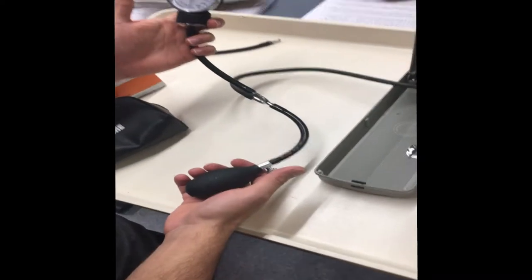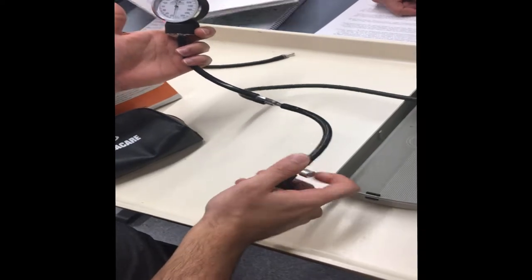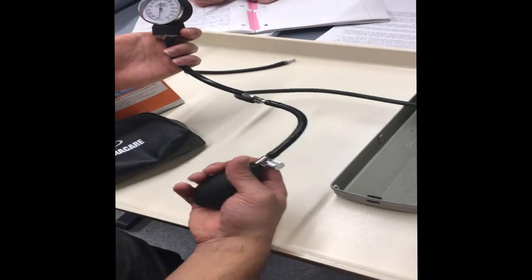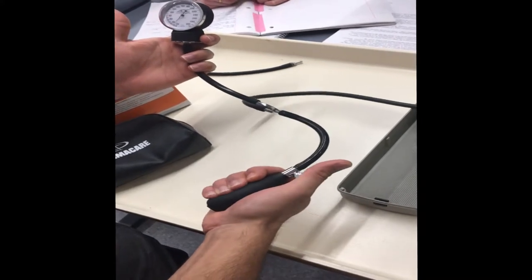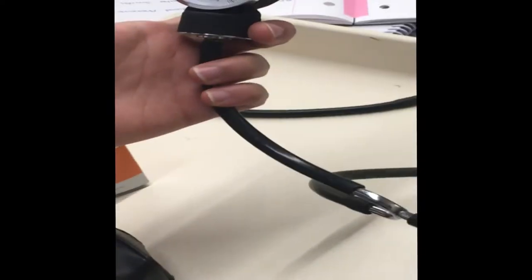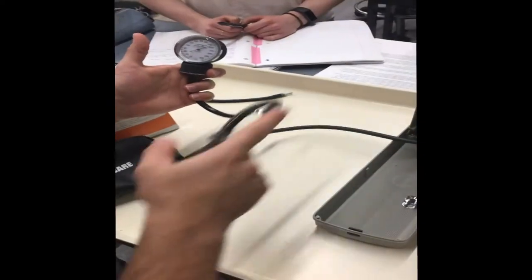In calibrating the aneroid manometer with the mercury manometer, you want to have the bulb placed at one end and the two manometers at the other end. By setting the pressure at about 200 millimeters of mercury, you can note the pressure on the aneroid manometer and the corresponding pressure on the mercury manometer.